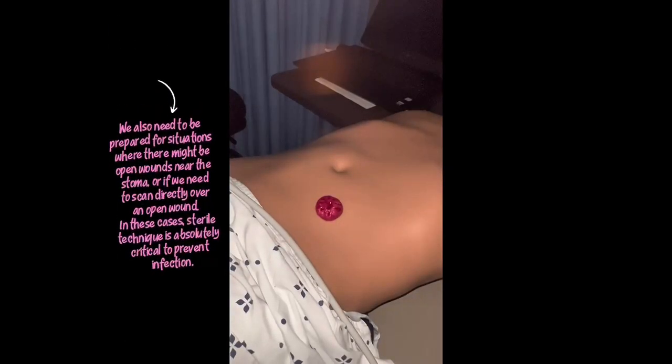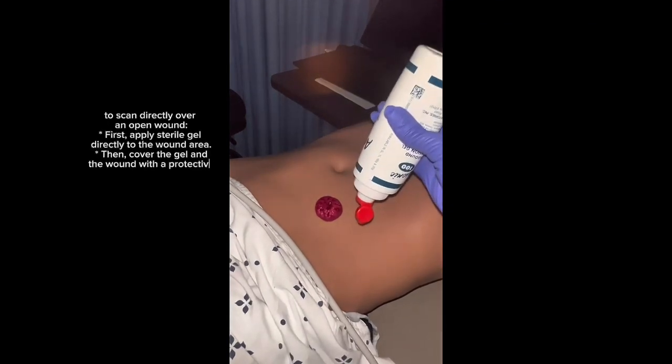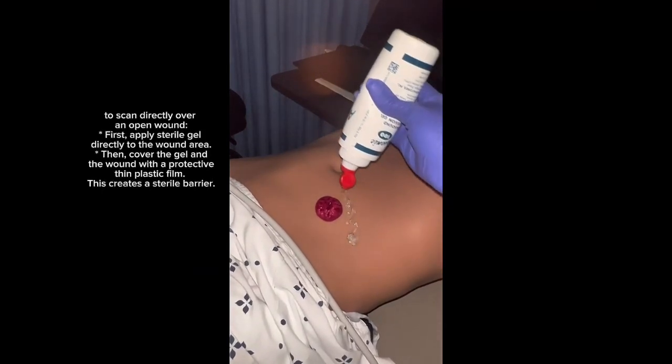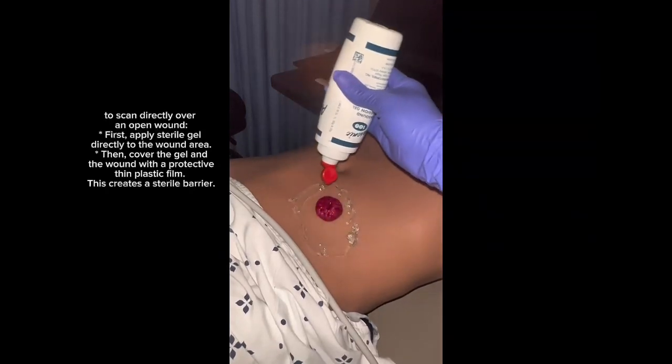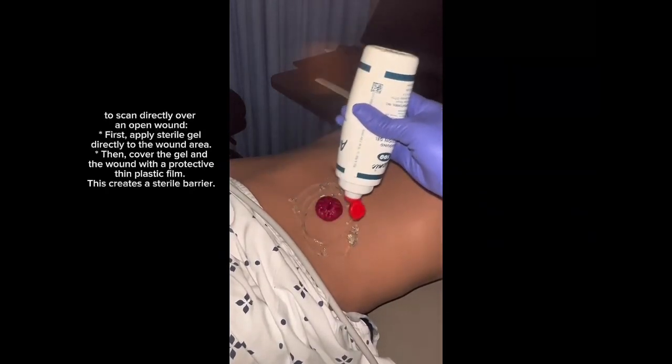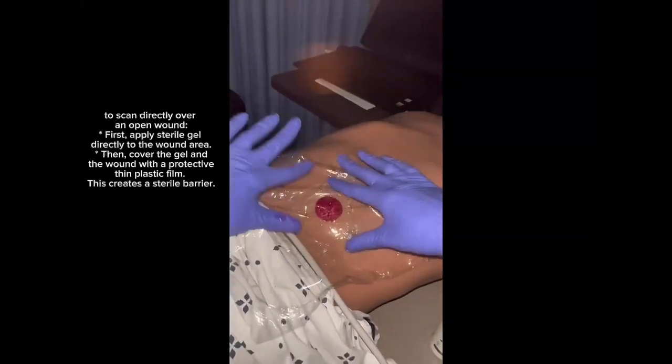We also need to be prepared for situations where there might be open wounds near the stoma, or if we need to scan directly over an open wound. In this case, sterile technique is absolutely critical to prevent infection. To scan directly over an open wound, first apply sterile gel directly to the wound area, then cover the gel and the wound with a protective thin plastic film.